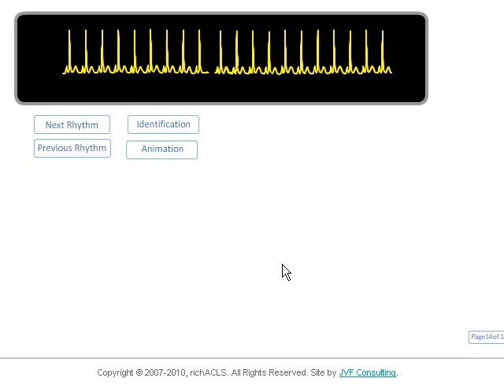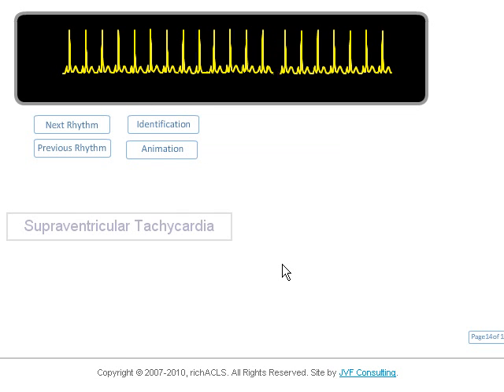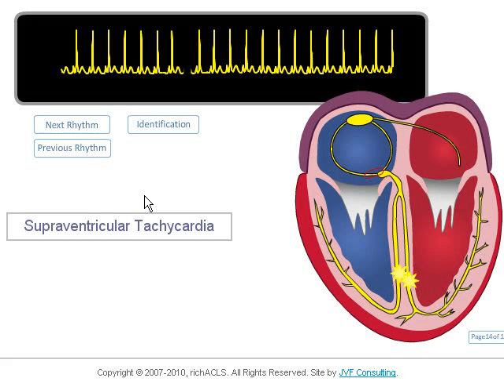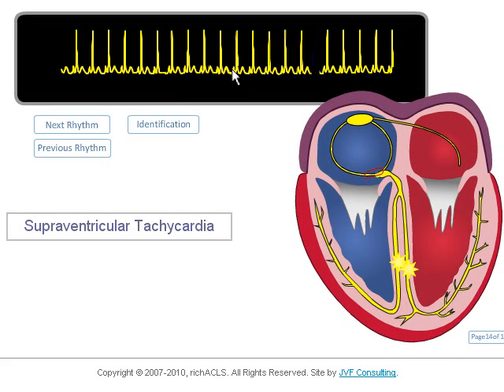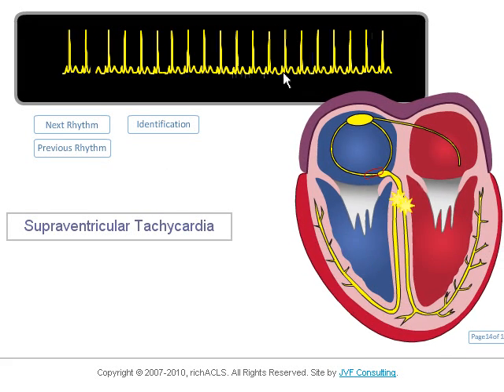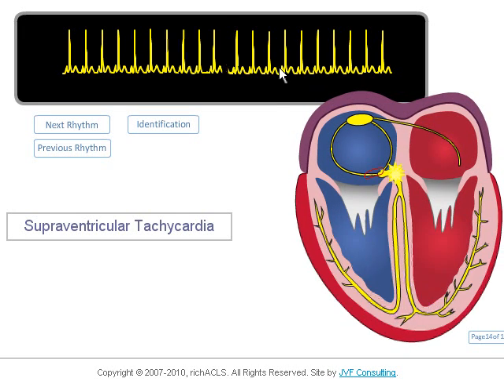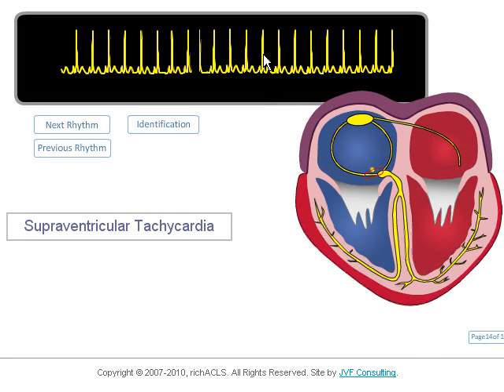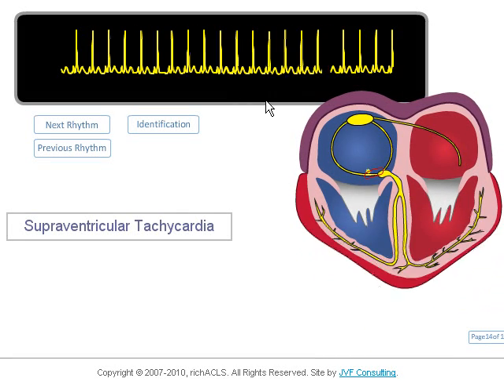In this first rhythm, supraventricular tachycardia, we have a fast, regular rhythm with a P wave in front of every QRS. The PR interval is constant with normal width, although hard to see with the fast rate. The QRS is narrow, and the rate is about 180.